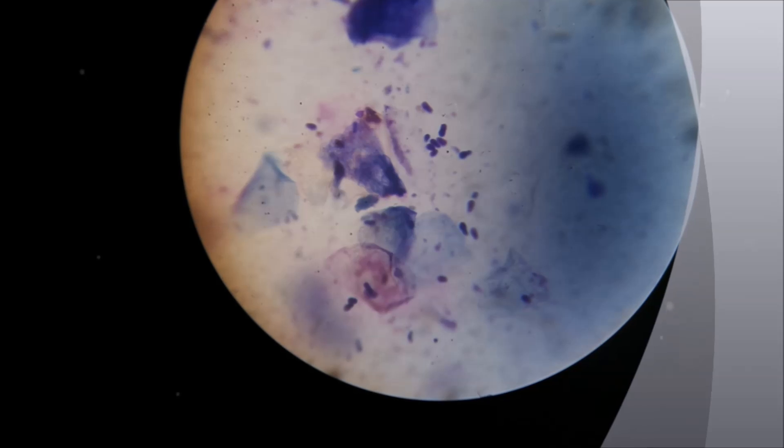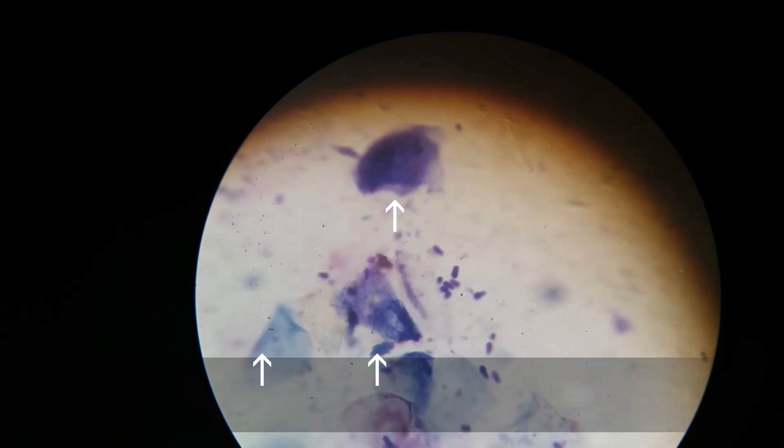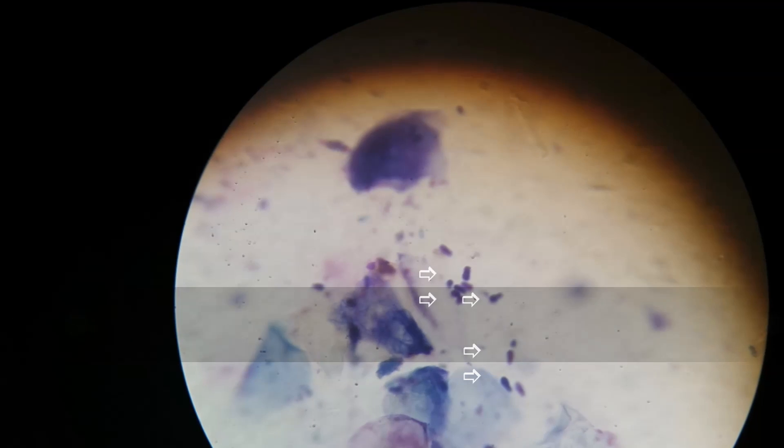And here we are now underneath the microscope. There are two things I'd like to point out: we have the squamous epithelial cells, which are represented here by the arrows — those are the large cells. And then we have these smaller, dark staining cells that are actually yeast. So Henry has a yeast infection in his ear, and we'll go ahead and treat appropriately.